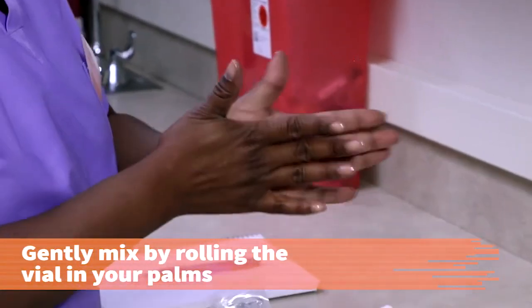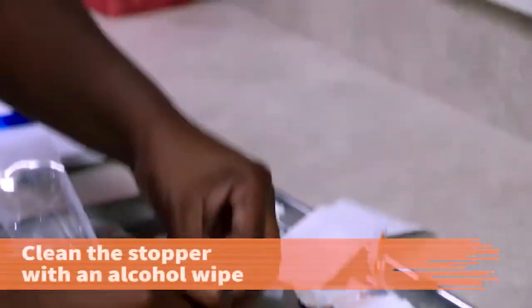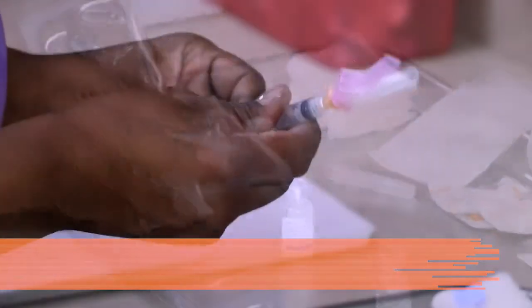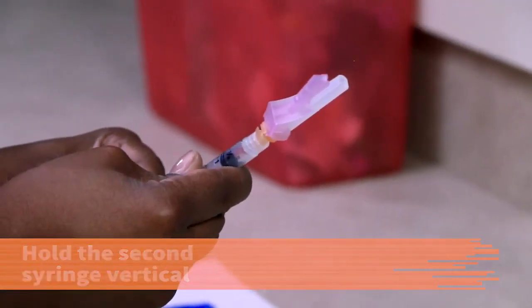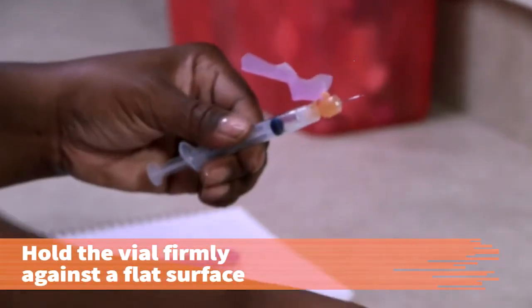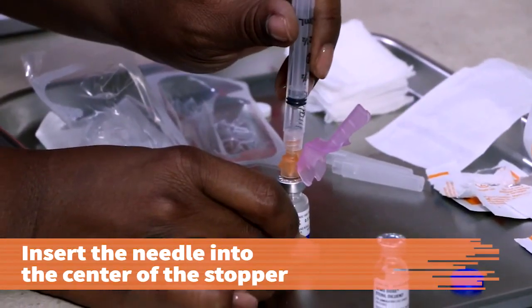Gently mix the vial by rolling it between your palms. Mix the medication until all the powder is dissolved. Clean the rubber stopper of the powdered medication vial with an alcohol wipe. Let the stopper dry. With the second syringe in a vertical position, pull the syringe plunger down. Draw up an amount of air equal to the amount of medication ordered. Hold the vial firmly against a flat surface. Insert the needle into the center of the dried rubber stopper.